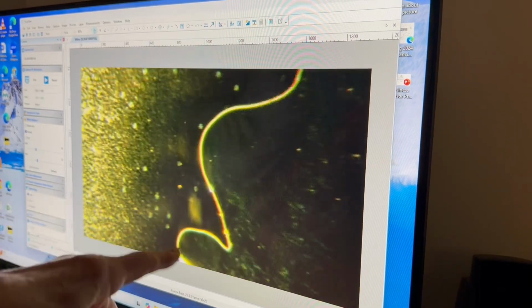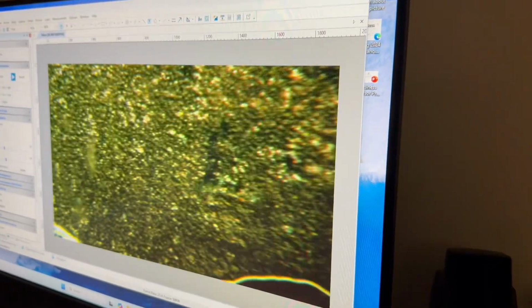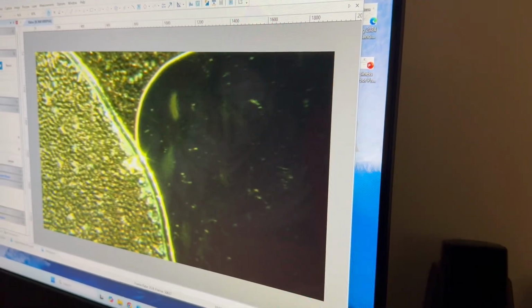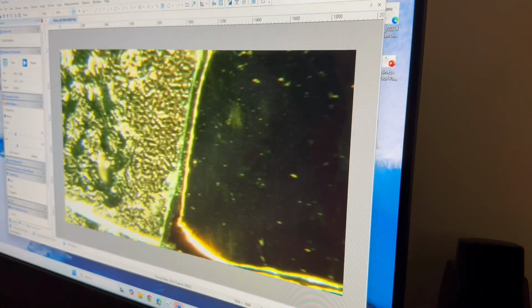See this? That's the edge of the actual blood. Oh. You're good. Nothing to worry about. Nothing to worry about. There we go. There is something right. Where? Let me look first. Let me get a sense.